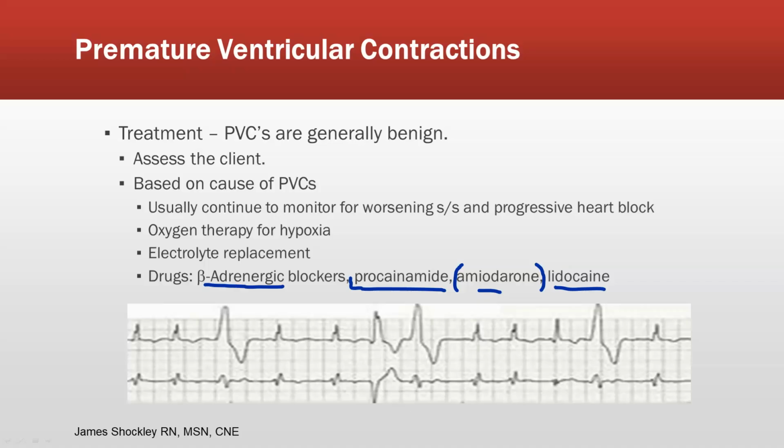So what I see down here in this strip is this client has a lot of issues going on. I'm able to see a bundle branch block. I do see an inverted T wave. I see a very wide and bizarre QRS happens, not kind of like where I would expect it. It doesn't appear to come early, but it's still considered a PVC based upon its information.